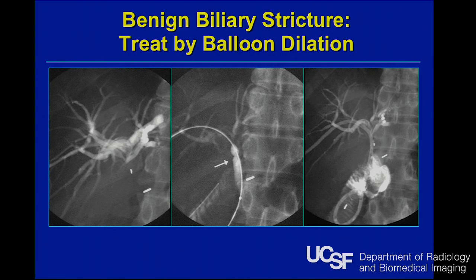In our hands, we perform these balloon cholangioplasties for a period of about 5 minutes and check in a month, and our patency rates for all comers and benign strictures is about 50%. Meaning we're actually able to get rid of the biliary drain at the end of this whole cholangioplasty process.